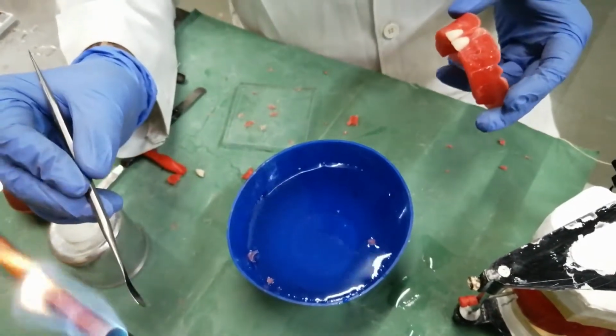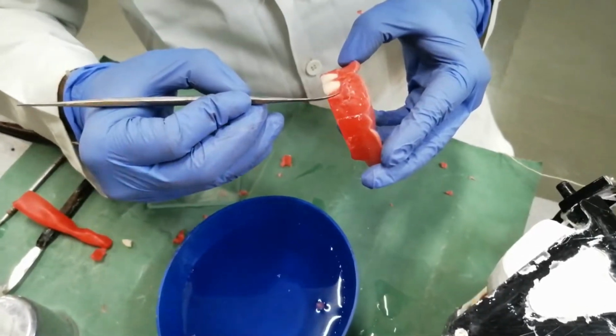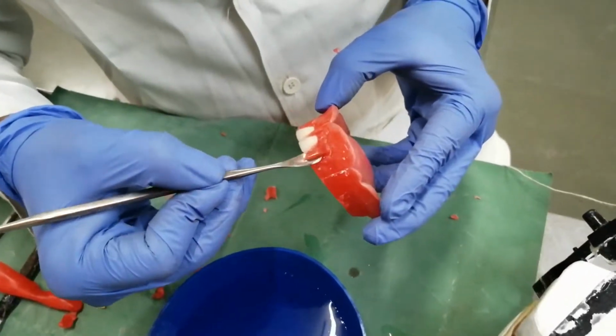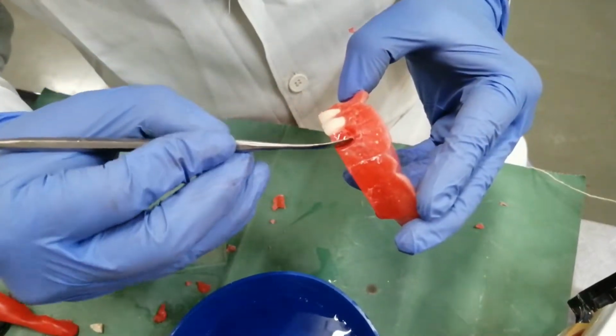Now we will place the lateral incisor. For that we are scooping out the socket. You have to keep in mind the height and width of the lateral incisor.